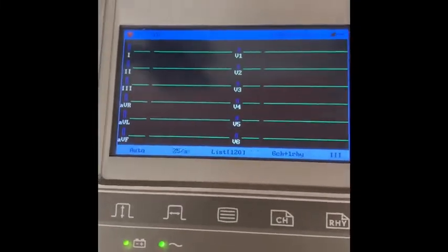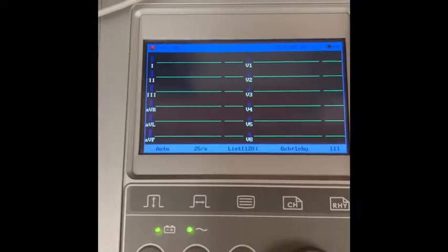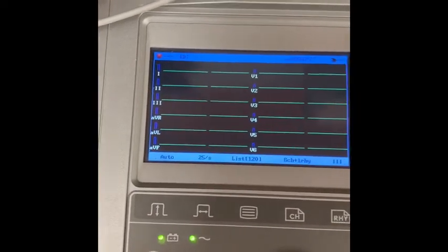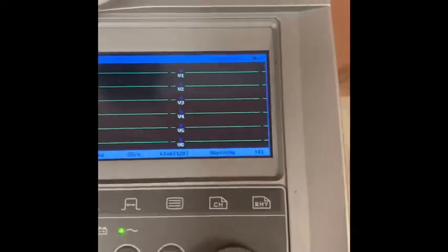Here is what an EKG will look like. As I told you guys it will actually have all of the leads listed on there. So if you look there you see 1, 2, 3, AVR, AVL, AVF, V1, V2, V3, V4, V5, and V6.